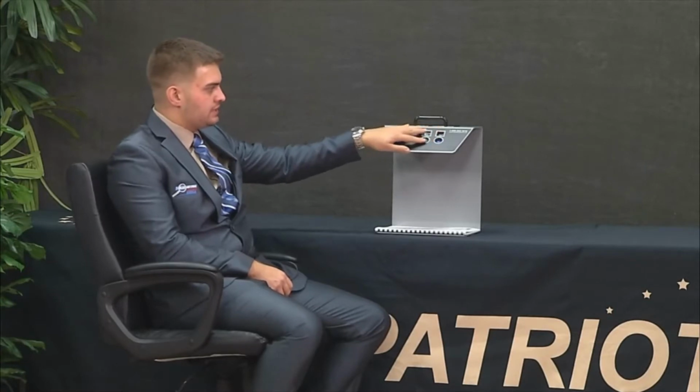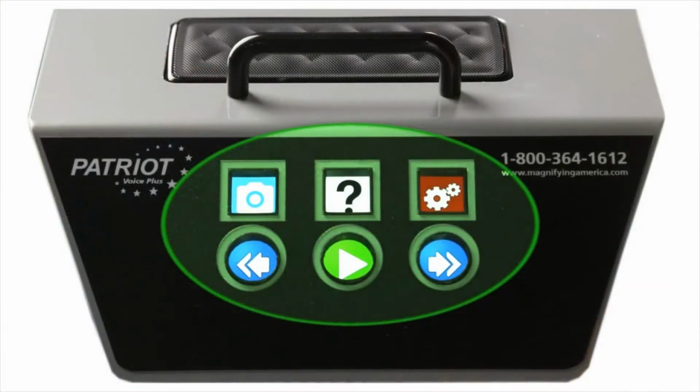So I'm going to pause the document right now, and I'm going to go over the buttons along the top. So there's 6 buttons along the top of the machine. They're tactile, illuminated, and recessed inside the machine.